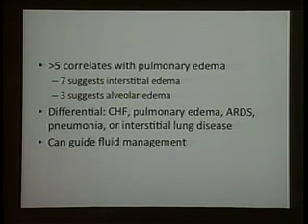Some people have used these lines to follow up treatment. Give a dose of Lasix, the lung gets drier, the B lines should basically start getting smaller and smaller. And some people use this for dialysis and things like that. Again, this is when your lung ultrasound becomes very fancy. You're gauging your volume status based on this, okay?